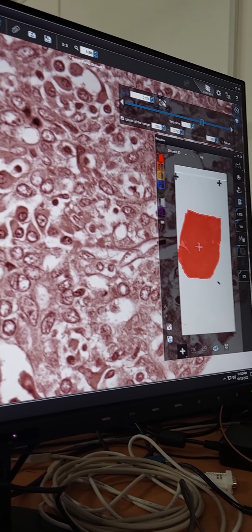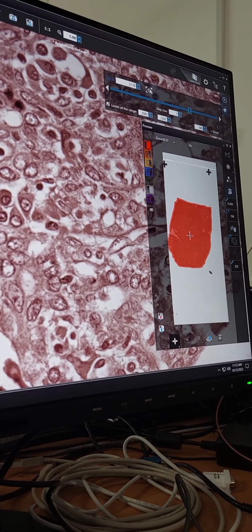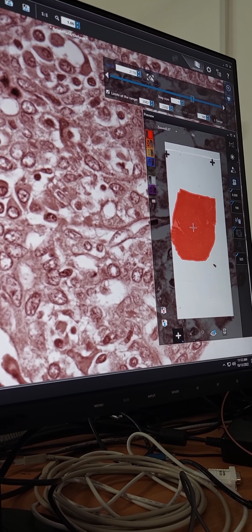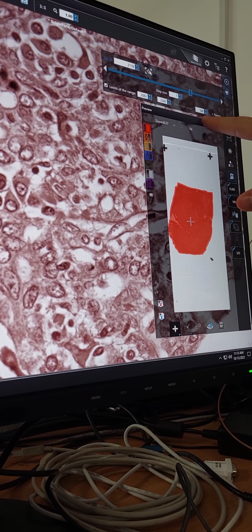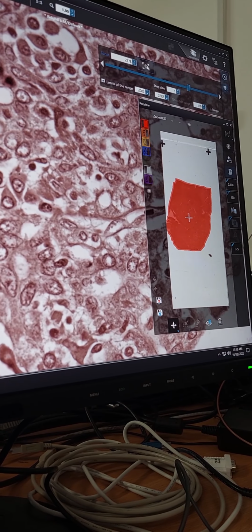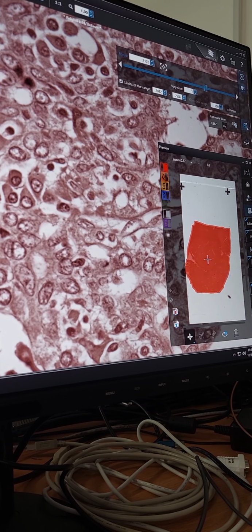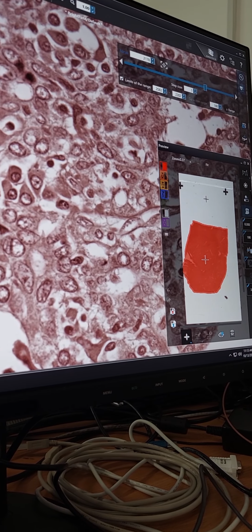This range is used during the scanning too? Yes. Before the scanning, when you build the focus map with the autofocus function, because you can also do that manually. But if you use the autofocus function, it will apply this range, and as you saw, it is very wise to choose a quite short range, so the focusing is going to be fast. Perfect. Yeah. You can also adjust the exposure time, but it is going to happen automatically anyway.